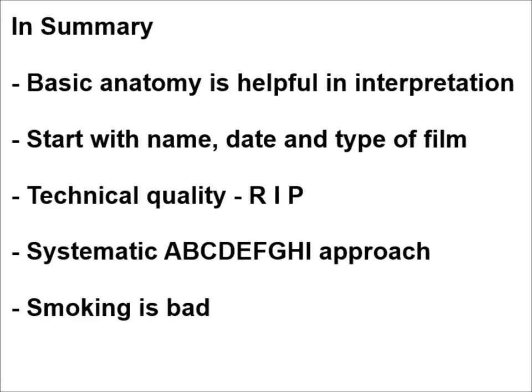Now that we've reached the end, it's time to summarize what you've learnt. A little bit of background anatomy goes a long way in interpreting chest x-rays. Start with the trivial stuff before diving into trying to diagnose the patient. Remember to comment on the technical quality using RIP. Use the A, B, C, D, E, F, G, H, I approach, and remember that smoking is bad for you.